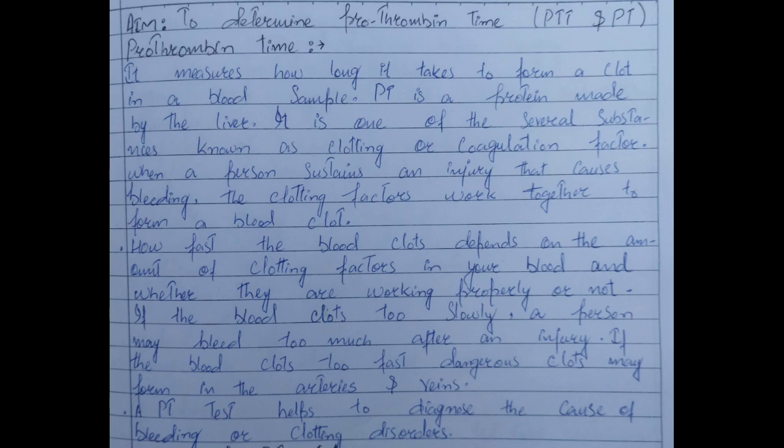ठीक, PT is a protein made by the liver. जो PT होता है वो एक प्रोटीन होता है जो लिवर बनाता है. It is one of the several substances known as clotting and coagulation factors. When a person sustains an injury that causes bleeding, the clotting factors work together to form a blood clot.